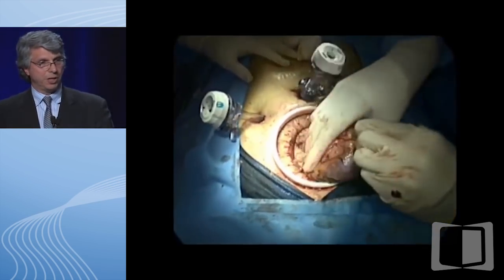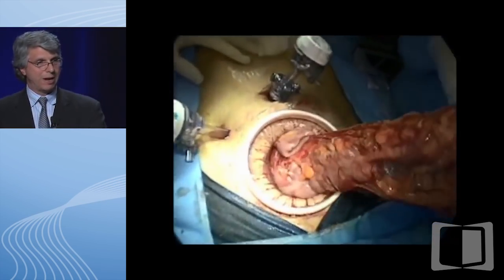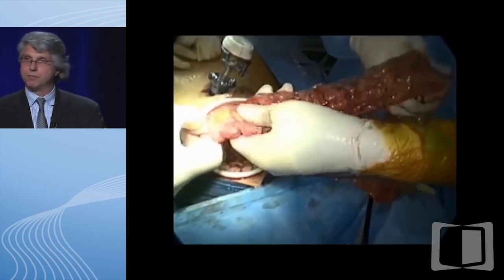This now is the fun part. We usually have the medical student do this, where we actually extract the colon.